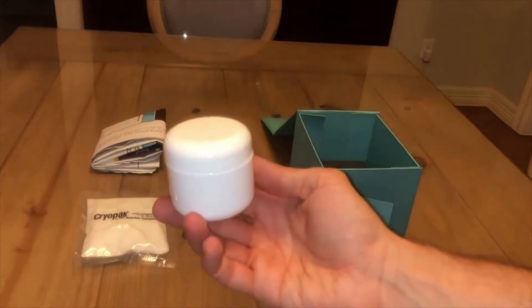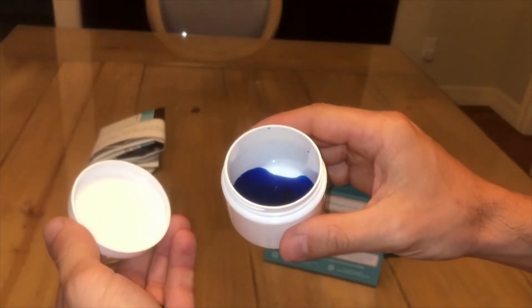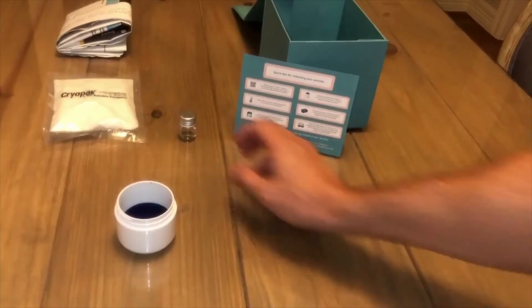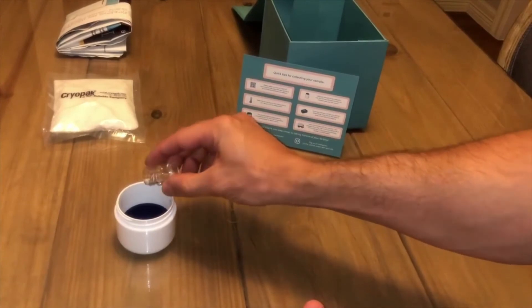Take the cup, unscrew the lid, and add your sample to the cup. Place the cup on a flat surface and add the sperm preservative to the cup. This will help stabilize the sperm during their trip to our lab.